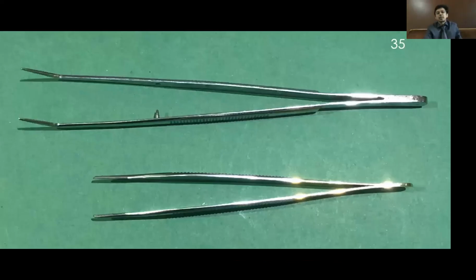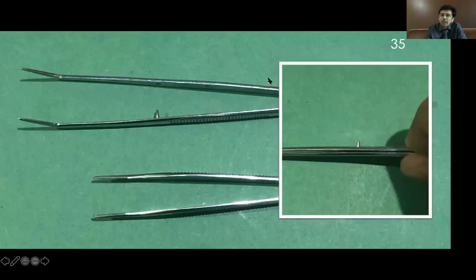The second instrument is, of course, a tissue holding forceps. All of you are aware of the difference between a normal tweezer and a tissue holding forceps. A tissue holding forceps basically has a nail and a hole here. The moment you over compress the tissues, this nail will be pinching on your thumb. It will tell you that now you are over compressing the tissue, so kindly relieve the pressure a little bit.